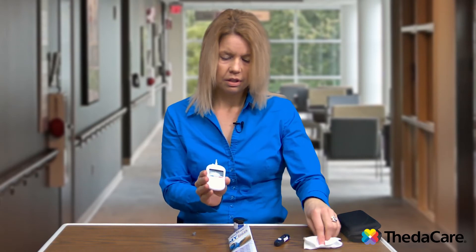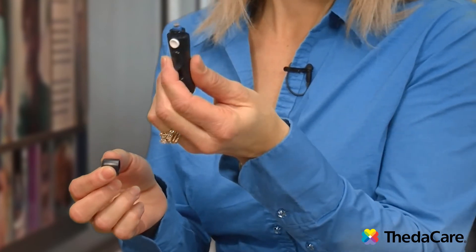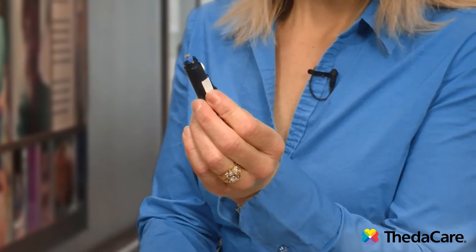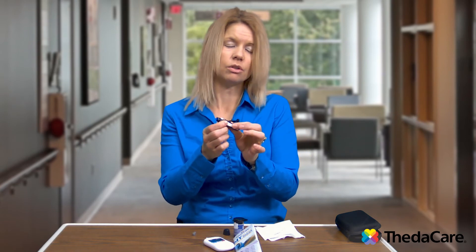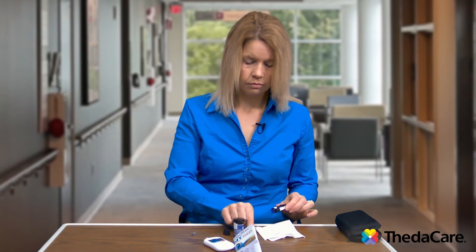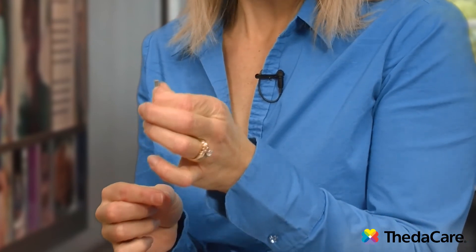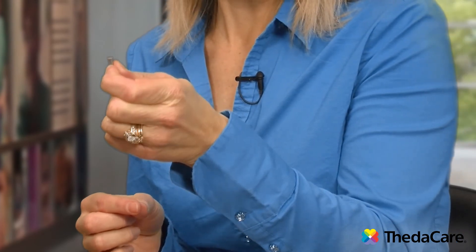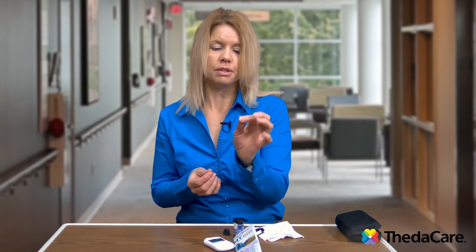When you are all done checking your blood sugars, you can take the test strip out, the meter will turn off, and you can throw that test strip away. With your lancet device, the actual lancet that you have used is considered biohazard, so you do not want to throw it in the garbage. With this device, I can take this little button, push it forward, and it does spit out the lancet. They don't all do that, so some you just have to pull out. Because it is biohazard, you want to either put it in a sharps container, or if you have an empty laundry detergent bottle you can write 'sharps' on it and keep these in there. Once you fill that bottle up, you can take it to any sharp collecting sites — some pharmacies will take them and dispose of them for you, or the ER departments at hospitals will usually take them.